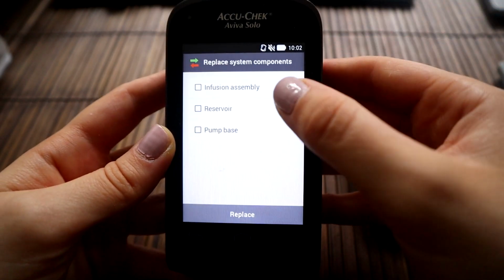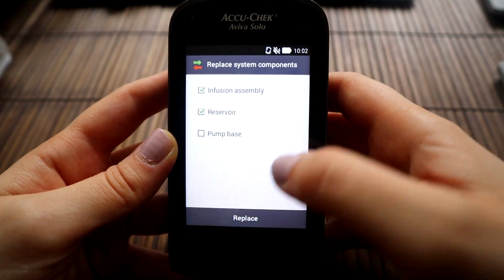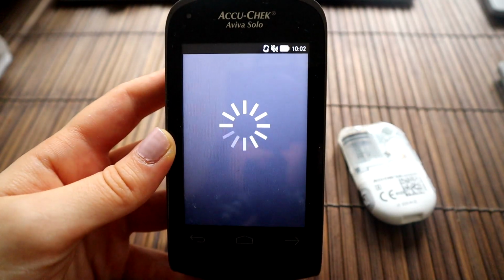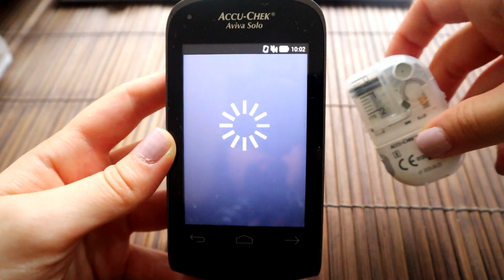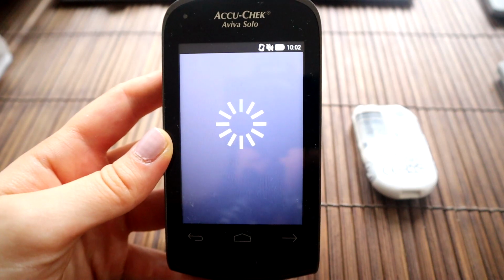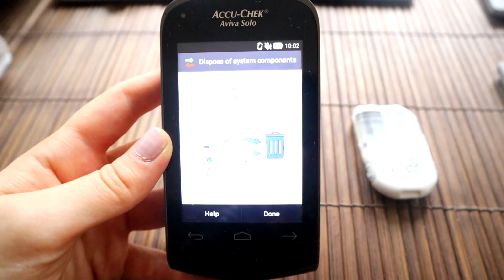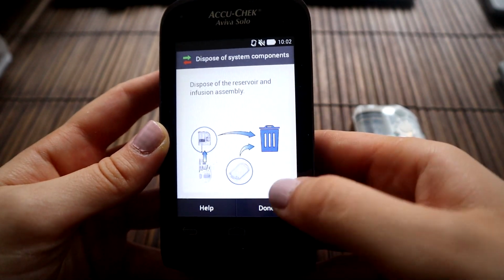So we have done the infusion assembly already, so I'm going to log on here that I've done it, and we're also going to do the reservoir. So then we click replace, and then it makes that beep to let you know that the insulin has now stopped going in, and it thinks for quite a while. Okay, it then says to dispose of the reservoir and the infusion assembly, done.